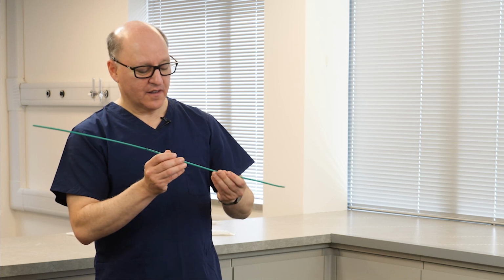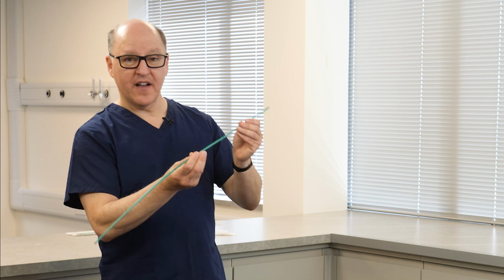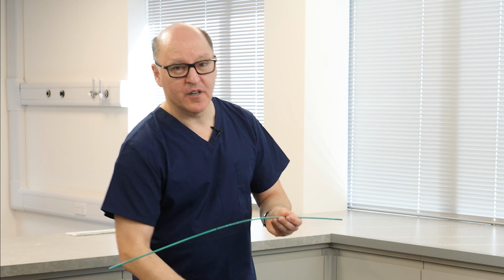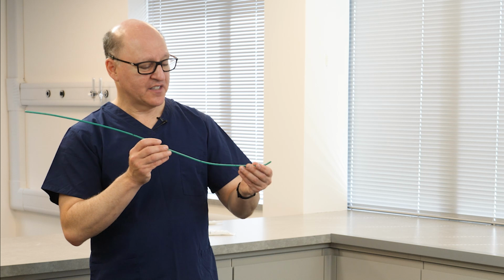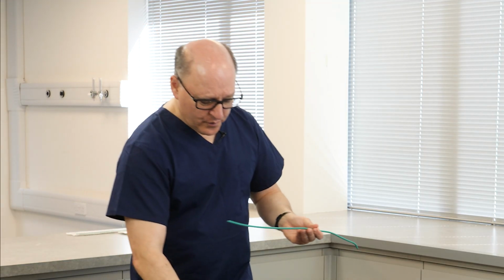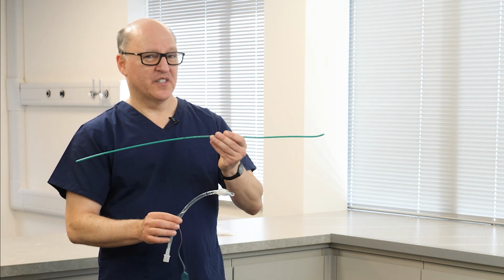And that's advantageous as we approach the target because on placement, the 5 millimeter outer diameter versus this tracheal tube, for instance, which is a 7.5 millimeter and has an outer diameter of 10, the bougie is half the outer diameter. So it's easier to place this towards the target without blocking line of sight. Additionally, it has an upturned distal deflection, which, if oriented correctly, gives you tactile feedback of the tracheal rings. So we started with tracheal tubes, moved on to adding a bougie to assist with this.